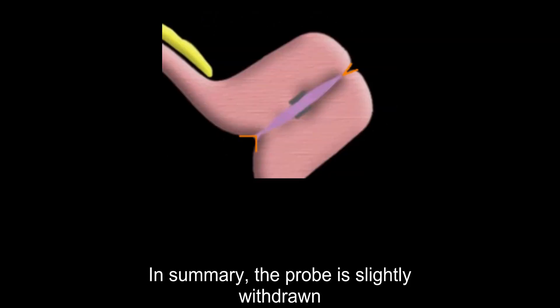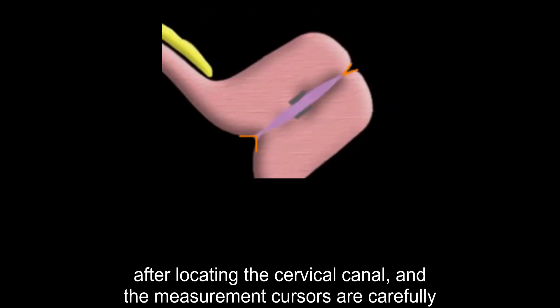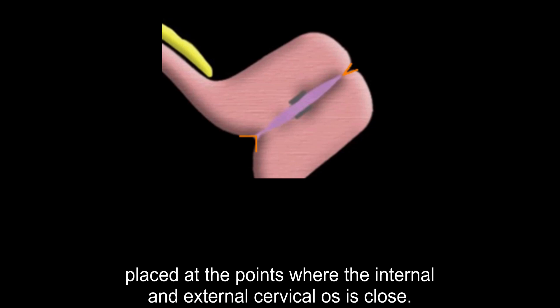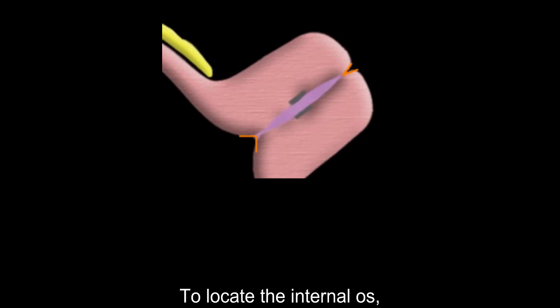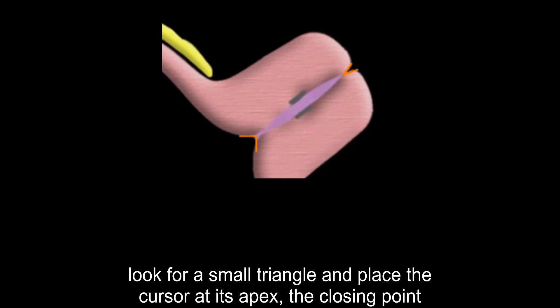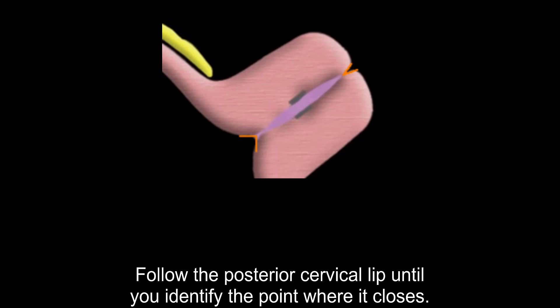In summary, the probe is slightly withdrawn after locating the cervical canal, and the measurement cursors are carefully placed at the points where the internal and external cervical os are close. Measure the distance between these points accurately. To locate the internal os, look for a small triangle and place the cursor at its apex — the closing point. For the external os, follow the posterior cervical lip until you identify the point where it closes.